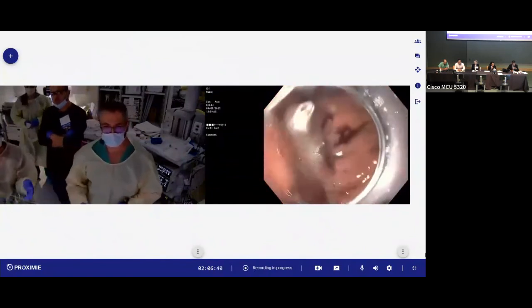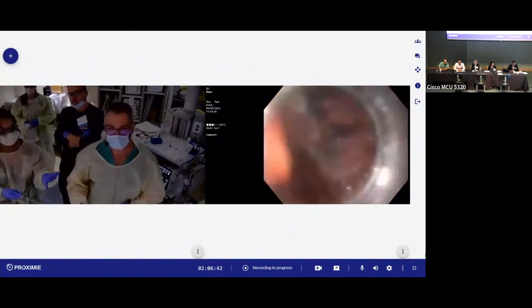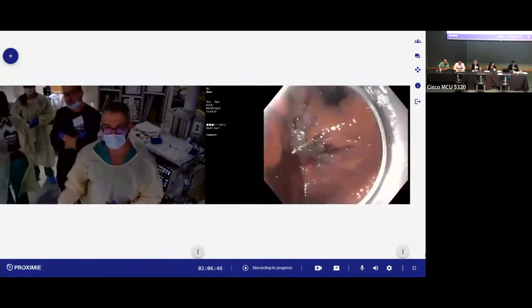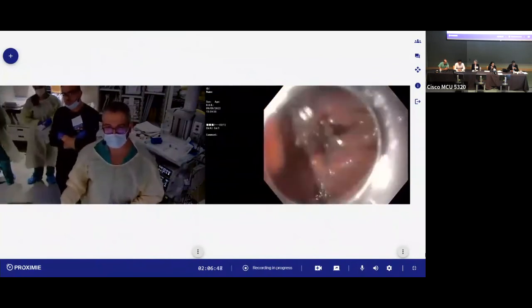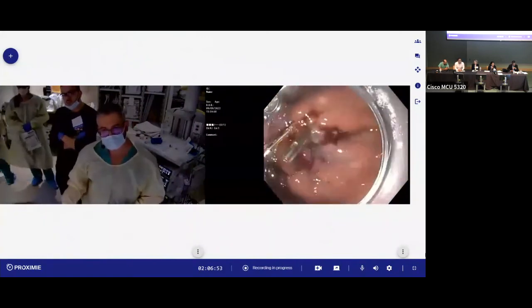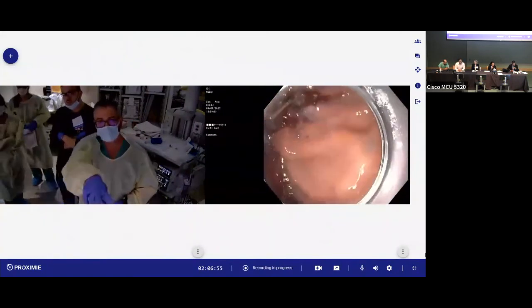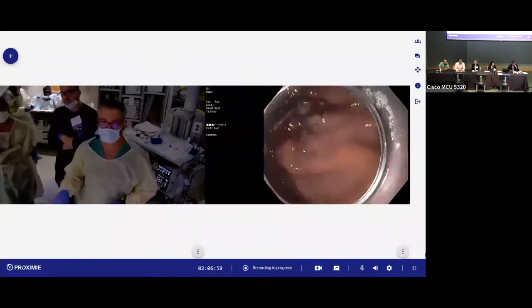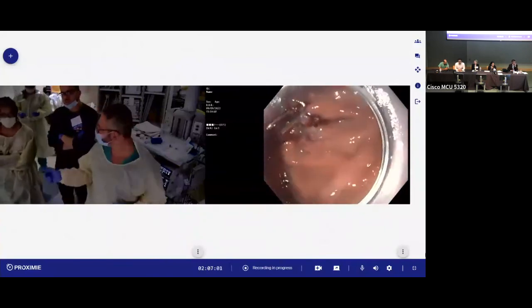Othman's doing a great job there, but also the clips sometimes don't do what they are supposed to do once they're U-turned on themselves. So that's another tricky part of it, but this is going really well. So we can maybe put another one down here, another clip, to close this defect, and we'll be done once we put the fourth one.